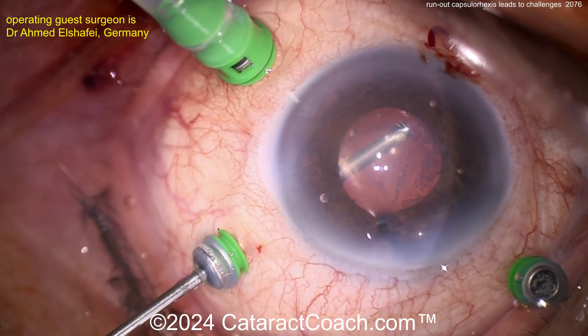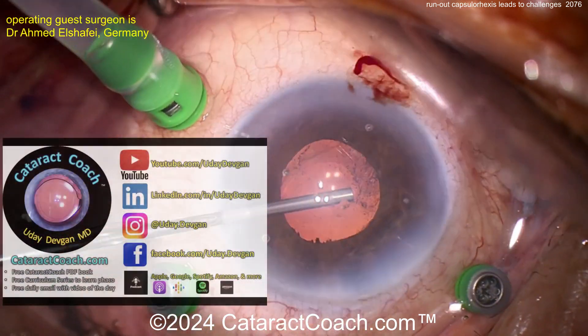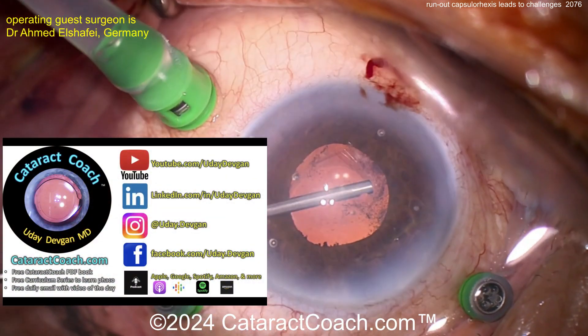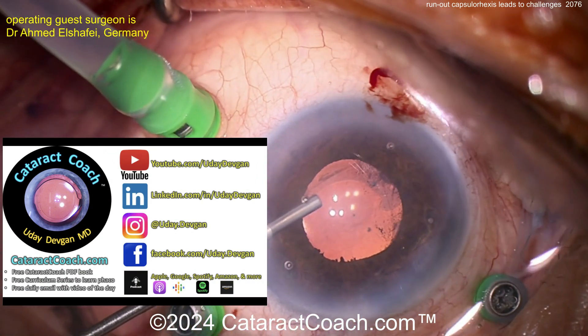That looks pretty stable to me — a nice result. All's well that ends well. Cleaning up that little bit of remaining lens material that was back behind the optic. That looks pretty good.